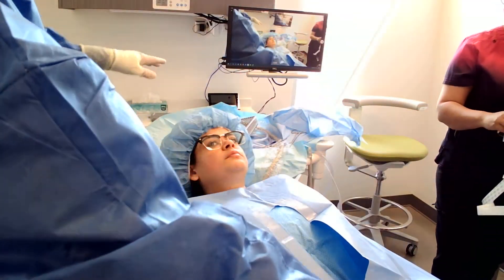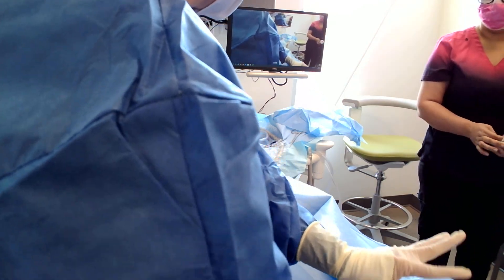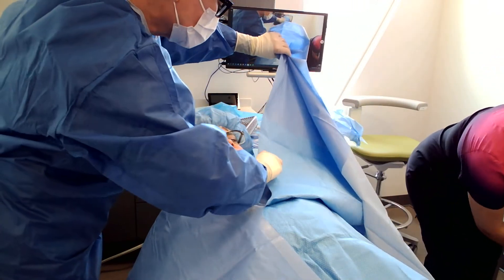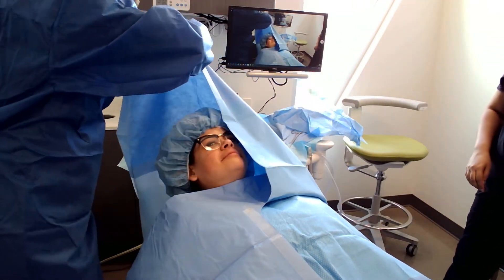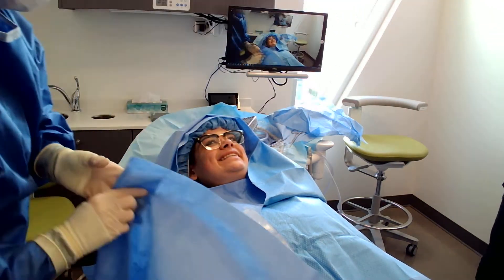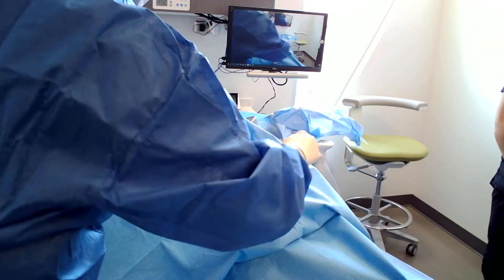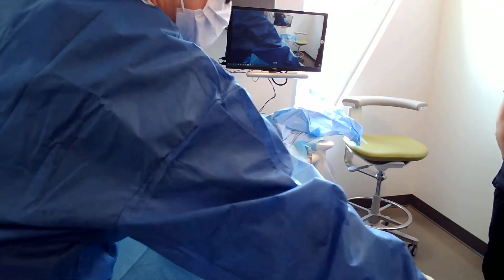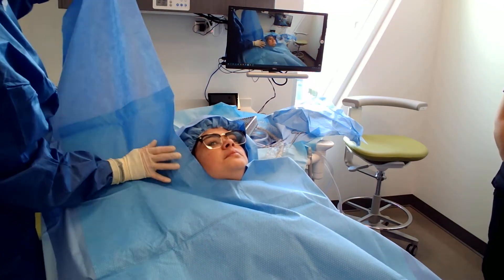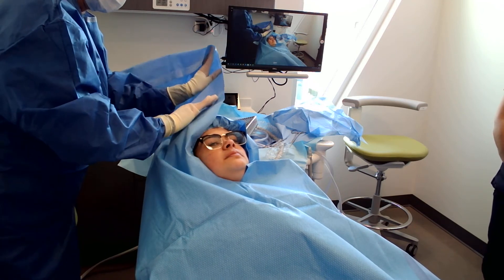One thing I likely would have done before bringing Courtney in is cover up the tray instruments a bit better so as not to alarm her. I'm going to cover her up like a little bug in a rug. So you can see how this keeps our field very, very sterile.